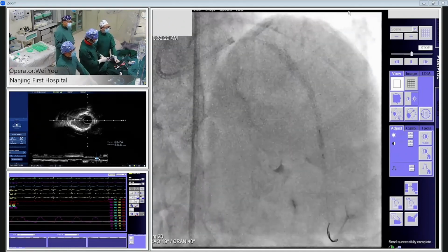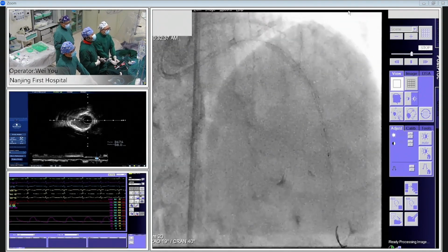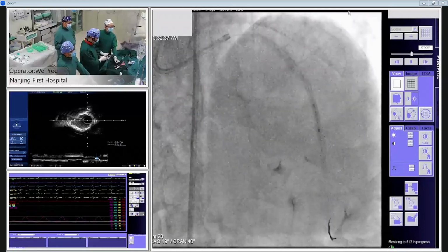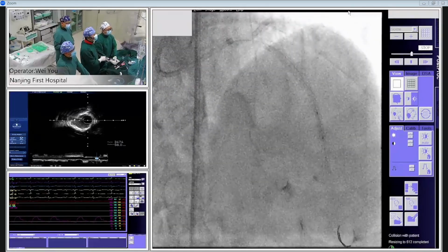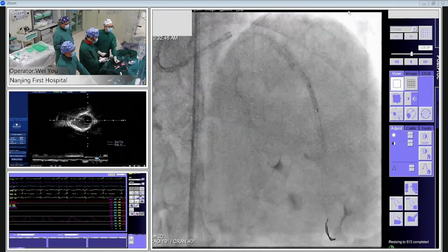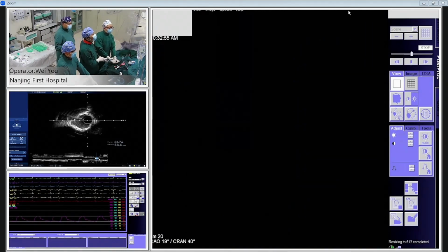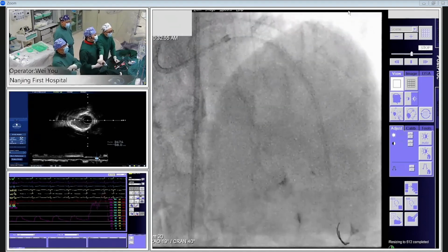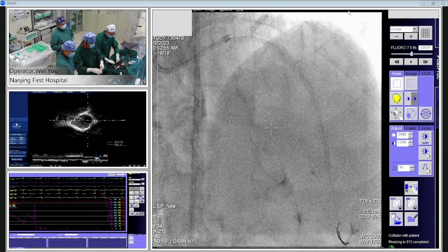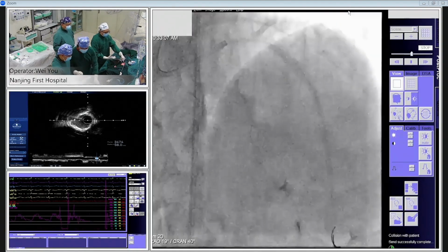And also at the proximal and distal stent edges, the plaque burden should be less than 50%, and without dissection involving the media longer than 3 millimeters. If all 3 criteria are achieved, we can call it IVUS-guided optimal PCI. So at 1 year TVF is only 1.6%. So we should not only use the IVUS, but also follow the IVUS optimal criteria.